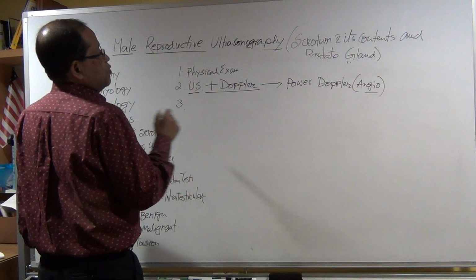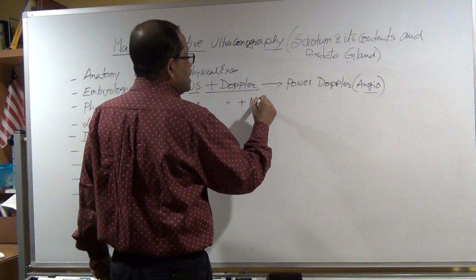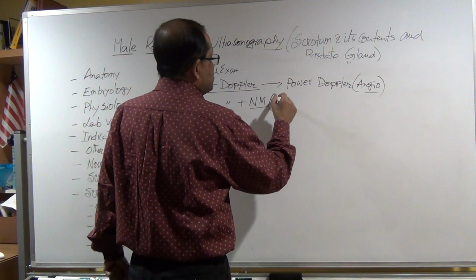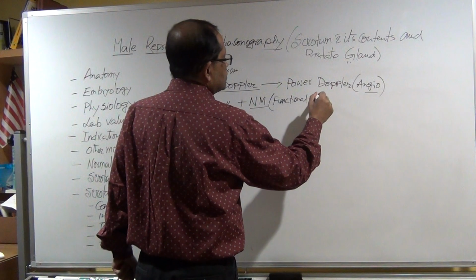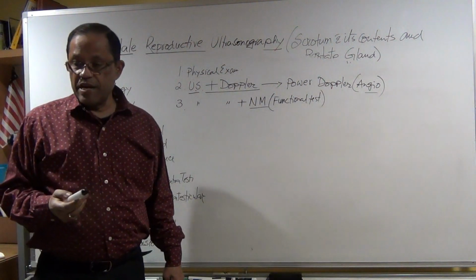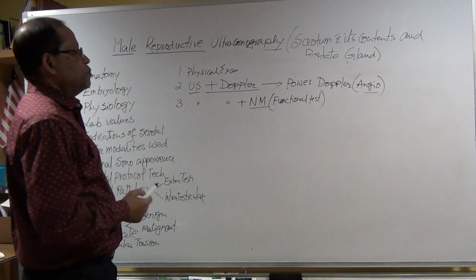Okay, so now some places will do this plus nuclear medicine. Nuclear medicine means a functional test. They will use the radioisotope.